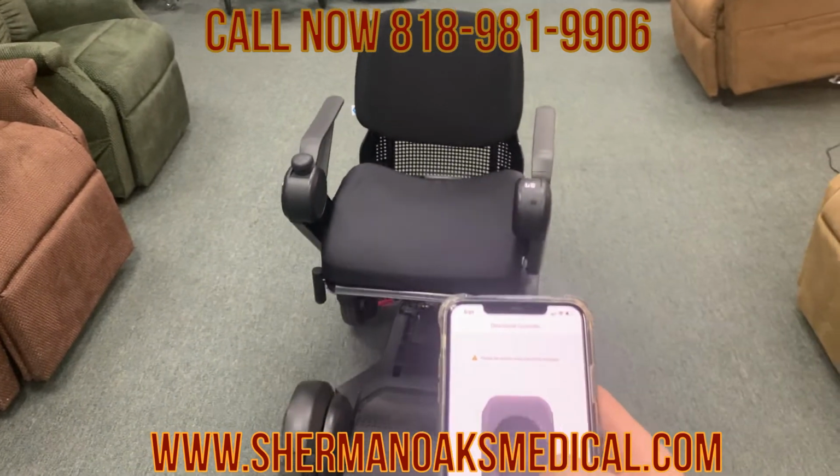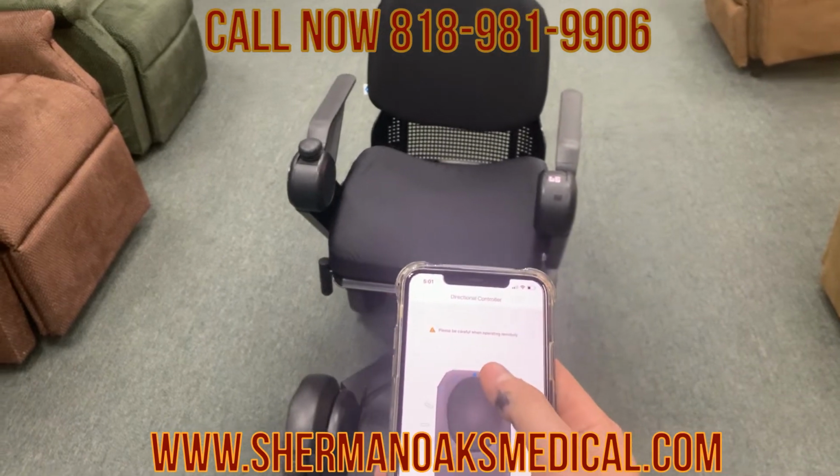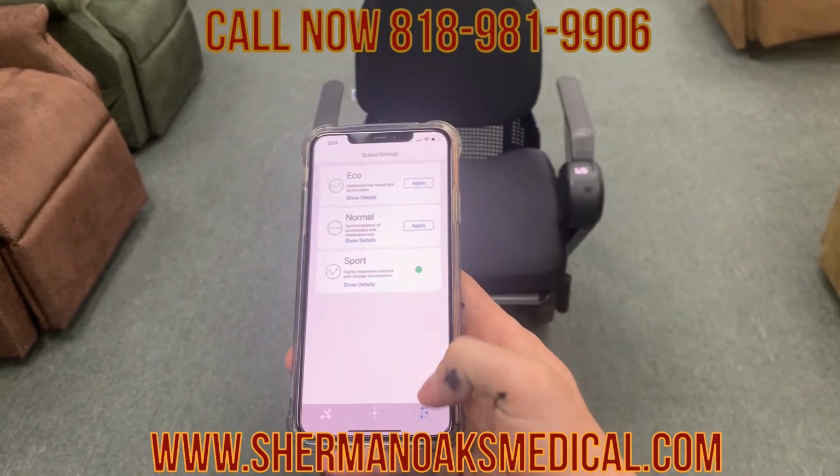Another user can also drive you around with it too, to just make it easier if you're someone that's too tired or just can't steer properly at that moment. Just a couple different reasons why it might help out. Just a cool thing that it has.